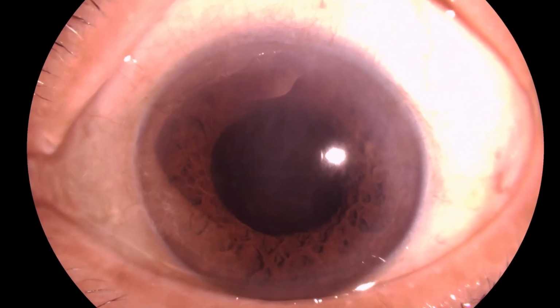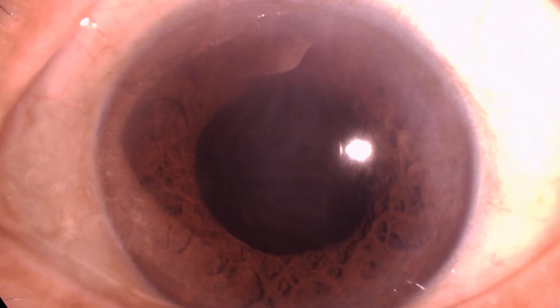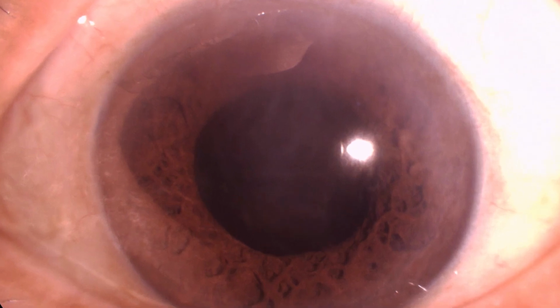This is the picture the next day. There's some amount of keratitis, although the patient's vision was 6/18 and gradually it recovered in a week to 6/9.